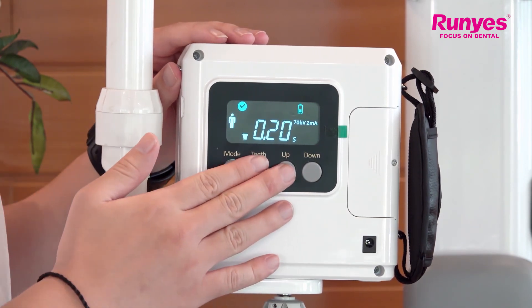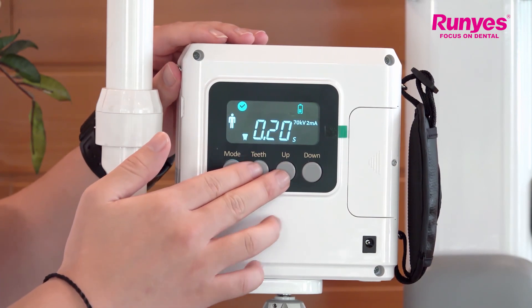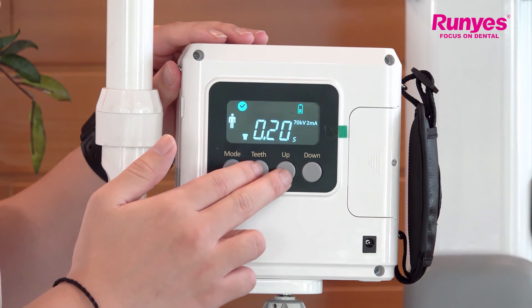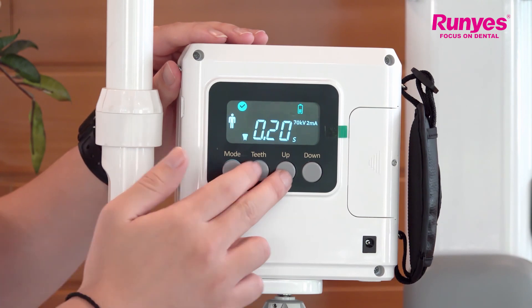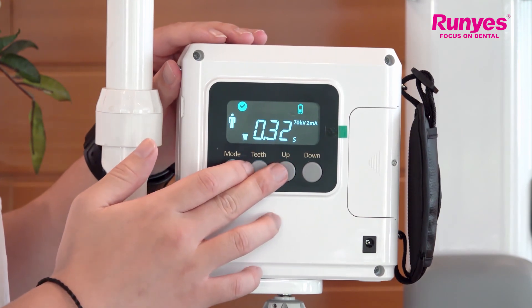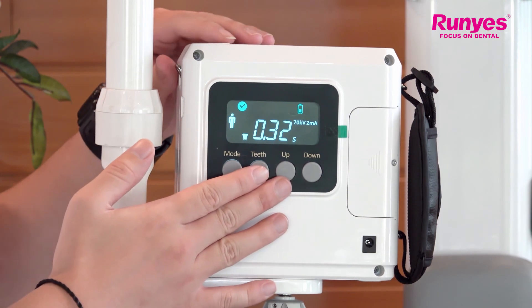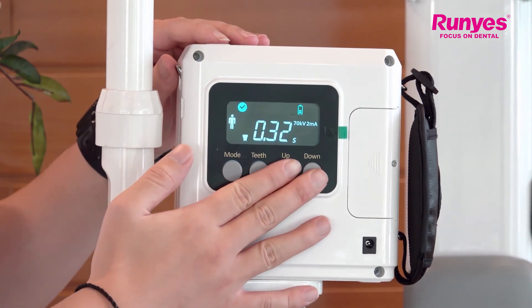For example, if you want to set the default exposure time by yourself, first you have to adjust the exposure time to the required exposure time by pressing the up and down keys. After selecting the desired exposure time, you can long press the up and down key for three seconds.